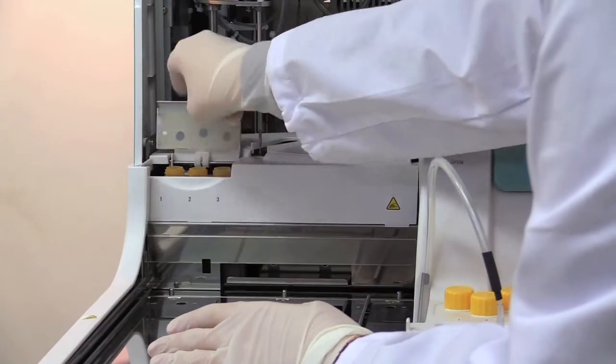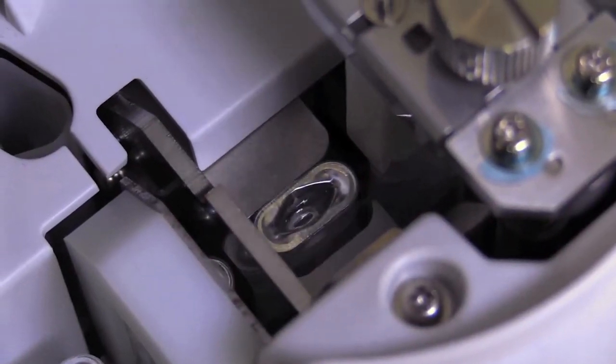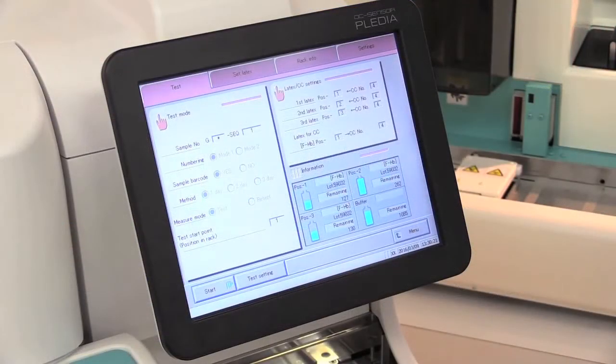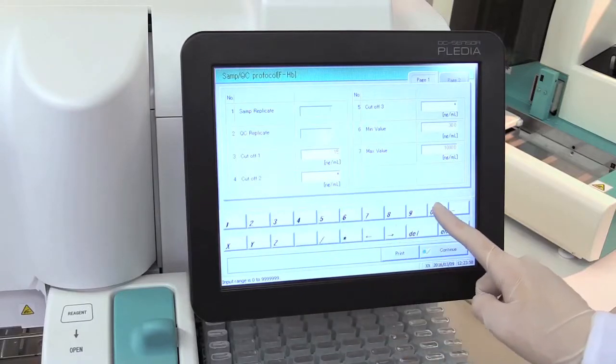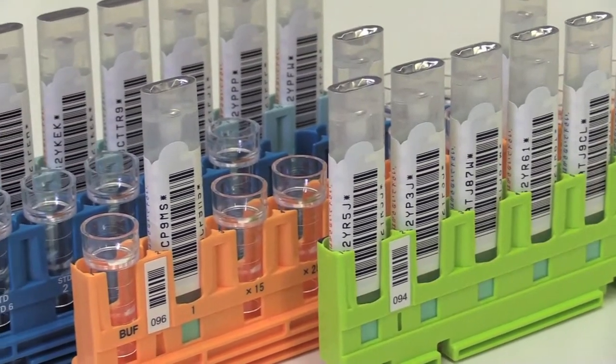There are two methods in fecal occult blood test, method of visual judgment and method that uses an analyzer. Analyzer has several advantages over visual judgment. First of all, automated analyzer could provide data. Secondly, barcode system management could be realized by a fast, labor-saving system. Thirdly, a quantitative result could tell the level of hemoglobin in feces. Furthermore, it is also possible to set the optimal cutoff value based on national and regional studies. Lastly, accuracy management can also be established.